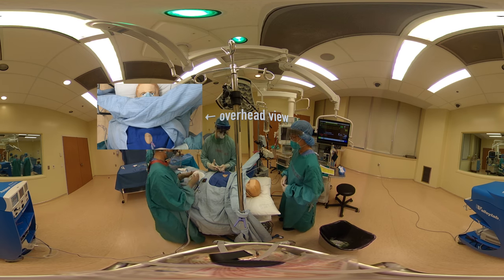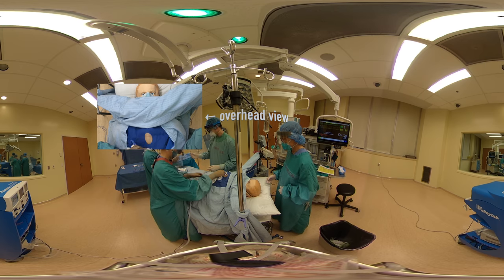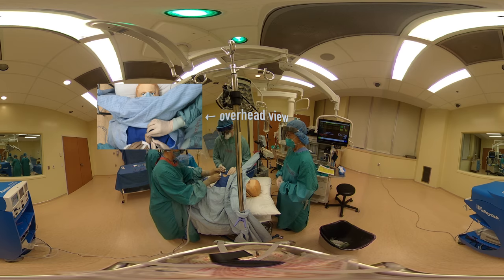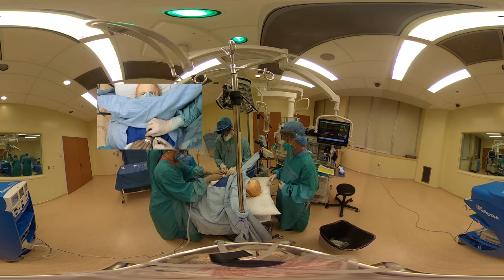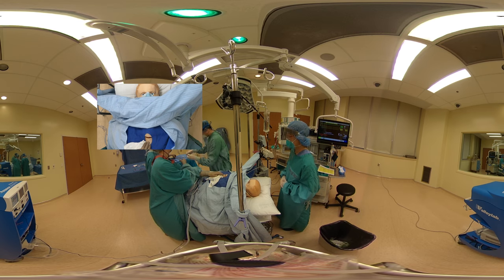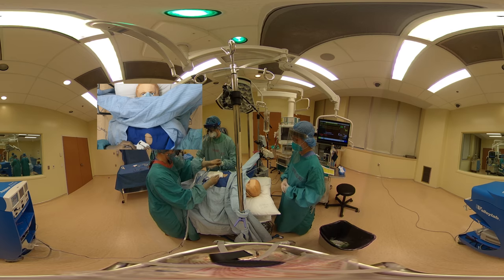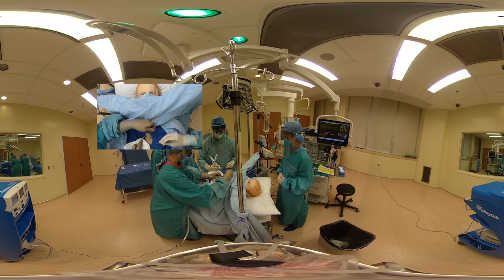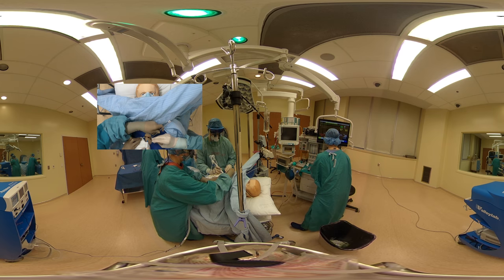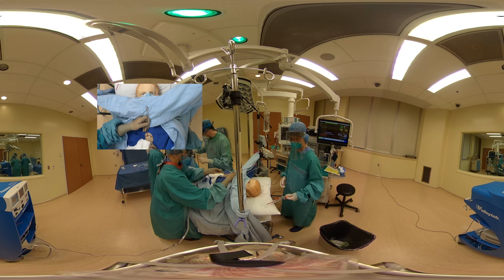We'll infiltrate some lidocaine into the soft tissue of the neck for analgesia and hemostasis. We're going to get started here and proceed quickly. Slow, deep breaths. Looks like the trachea is exposed there.